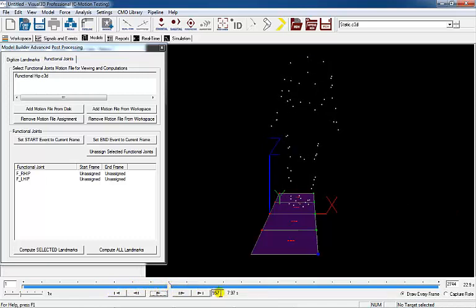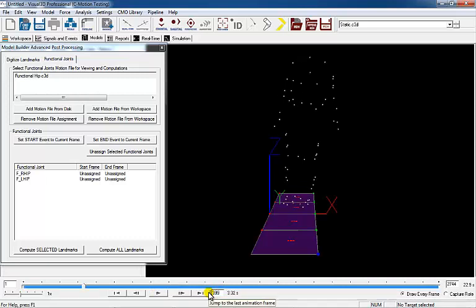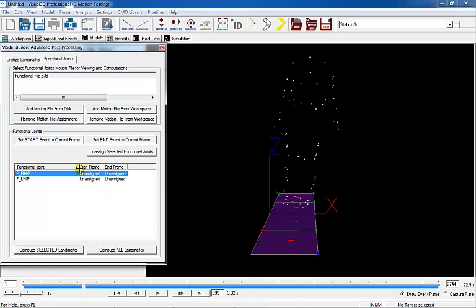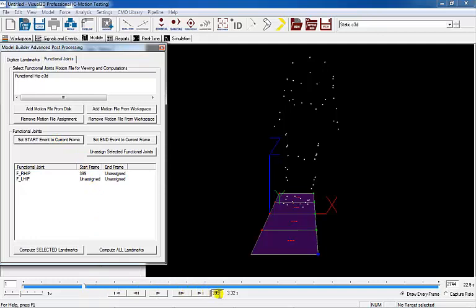Select the beginning of the right functional hip joint motion by going to frame 339, selecting FR hip joint, and click Set Start Event to Current Frame. The frame will appear in the start frame list.